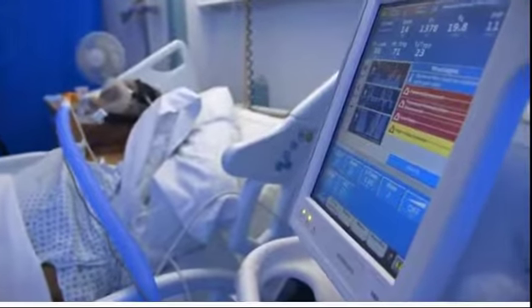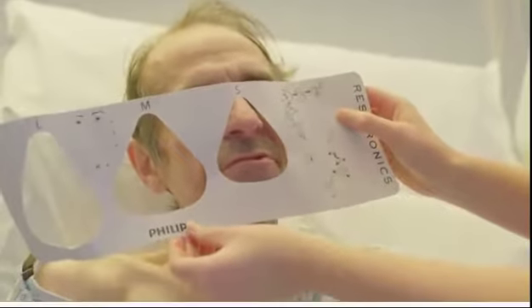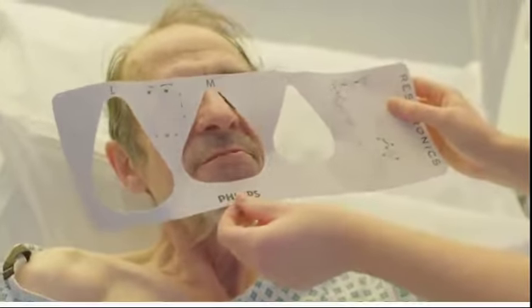the treatment. How we approach patients during NIV setup can help them understand the treatment more and be able to tolerate it better. This video is going to take you through a patient-centered setup of non-invasive ventilation. Before starting a patient on NIV, there are 5 essential things to think about. The first one being, is NIV indicated?